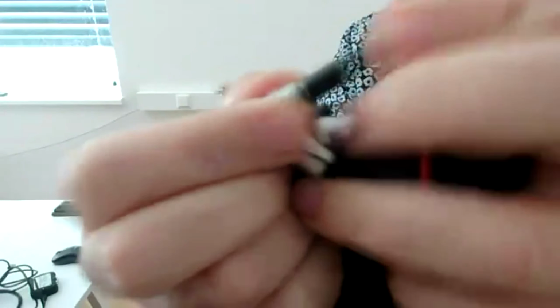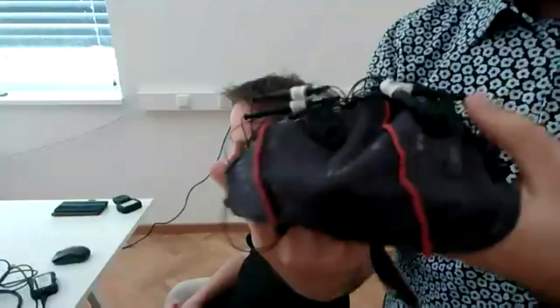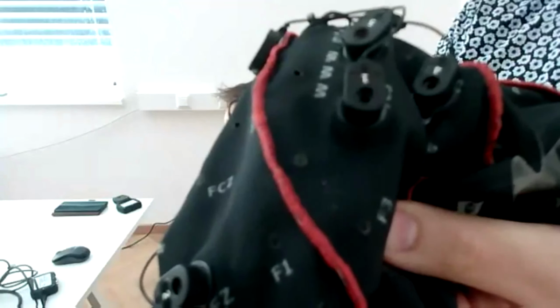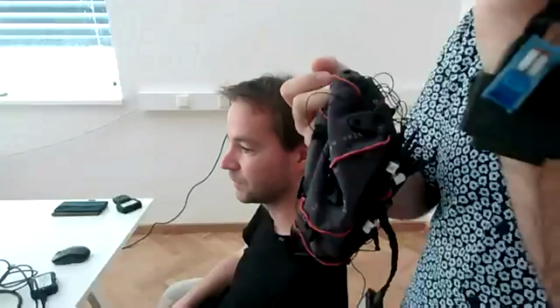And this version, like I mentioned, is the multi-purpose version, which has a connector that you could connect, for example, different kinds of applications like sensors, EMG, ECG, whatever. And then we have the other cap, which is the same that we use for Alex. So it's a g.SCARABEO cap. They have the connectors here, which we will connect to the amplifier.